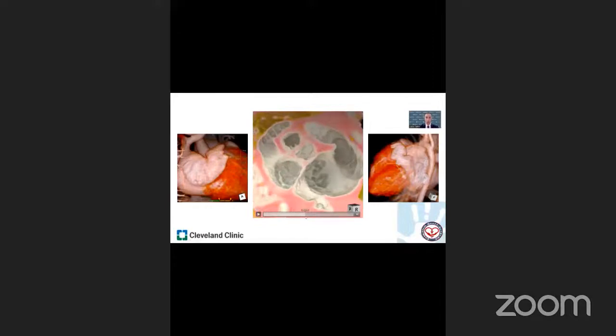And then if we rotate, however, into the short axis and we interrogate the atrial appendages, then we can appreciate that this right-sided atrium is in fact a morphological left atrial appendage, even though it's dilated, related to the fact that it has both the entirety of the systemic caval venous drainage along with some of the pulmonary venous drainage into this right-sided atrium.